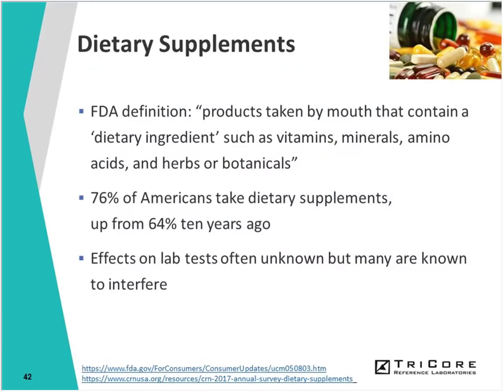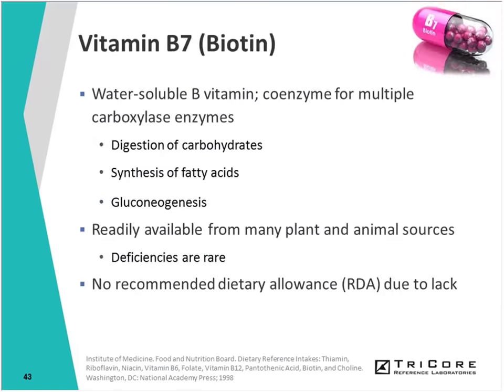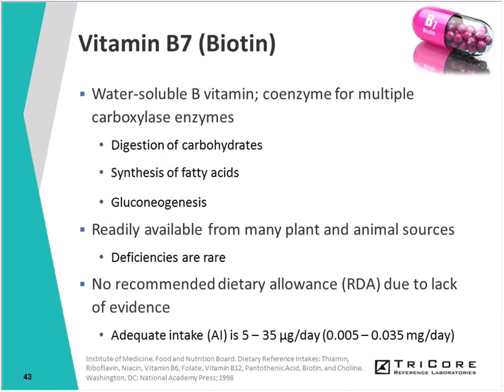And the same is true for dietary supplements, the use of which has risen dramatically over the years. And like drugs, the effects of these may be unknown, but there are some that are well known to cause interference. And the vitamin supplement getting the most attention today, it's no secret to anyone, is vitamin B7 or biotin.